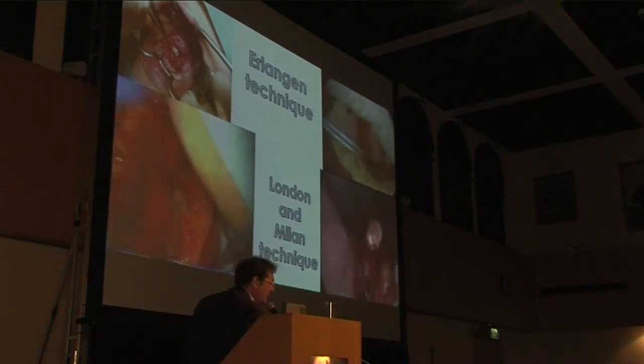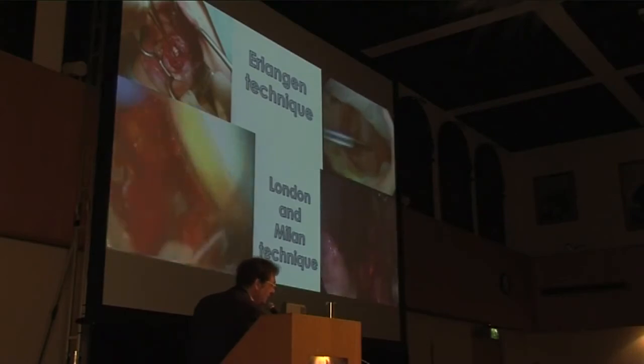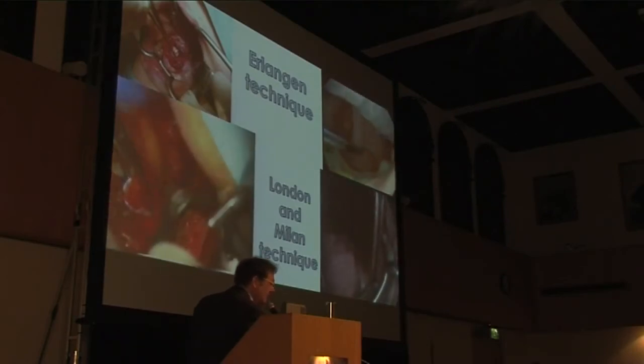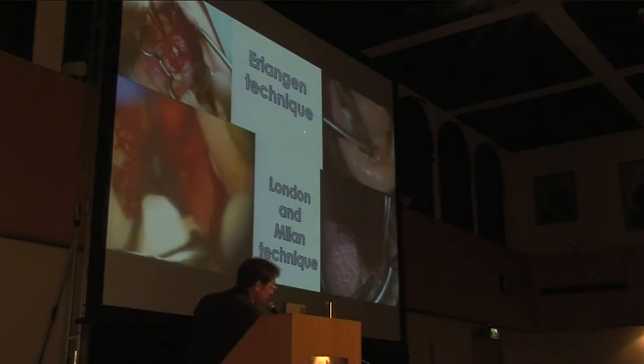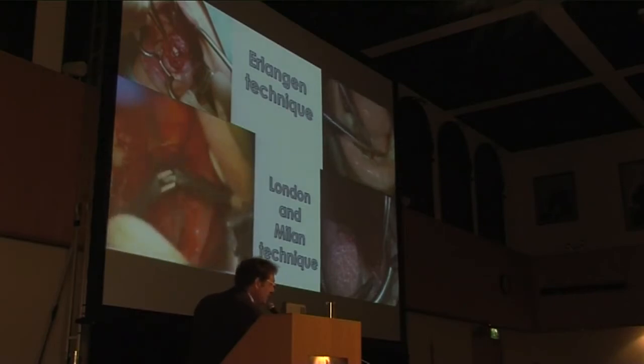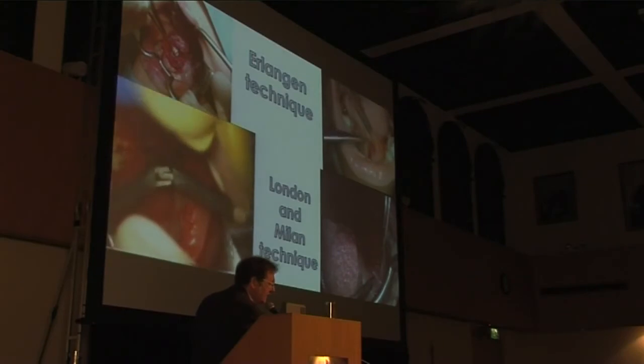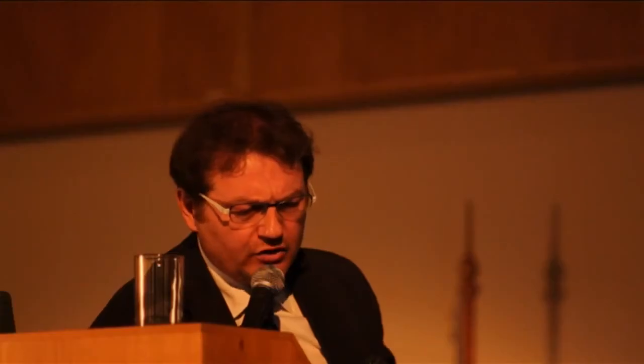We perform the incision directly into the hilar region or into the parenchyma. But you need to know both techniques, as sometimes I use the prolonged duct dissection, especially when you have ductal stenosis distal to the stone — it is better to open up the duct and then remove the stone. According to the new sialendoscopic techniques, by making conservation of the entire duct, you may be able to have an endoscopic check during surgery and also a postoperative endoscopic check at the end of the procedure.